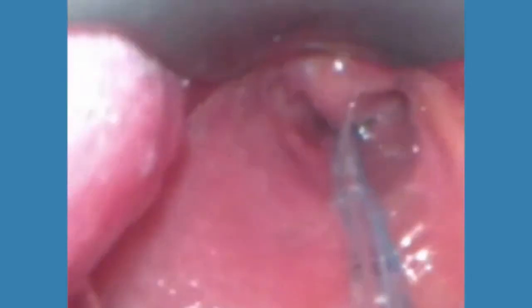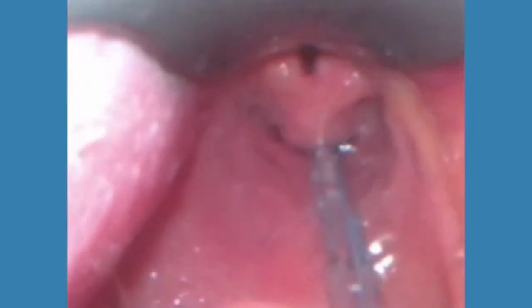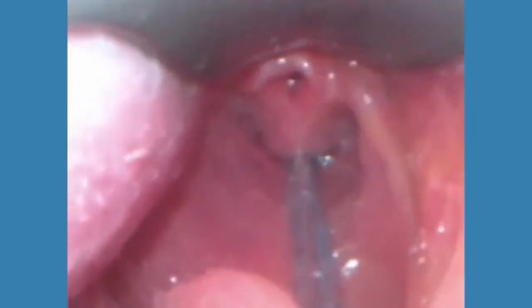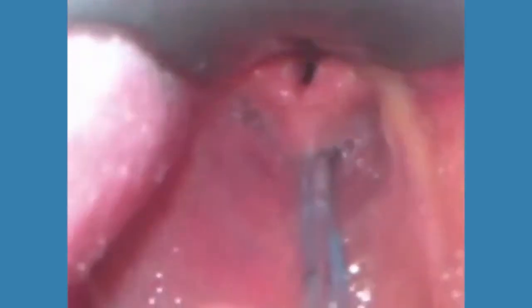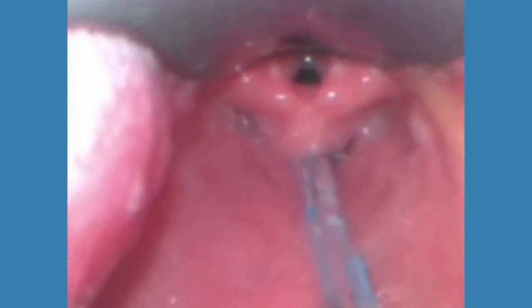This clip shows the infant's airway during intubation using video laryngoscopy. The laryngoscope blade is at the top of the screen. Here, the operator is looking for landmarks. An OG tube is in the esophagus at the bottom of the screen. The vocal cords appear. The top of the blade is in the vallecula. Now the tip of the blade lifts the epiglottis, exposing the open vocal cords.